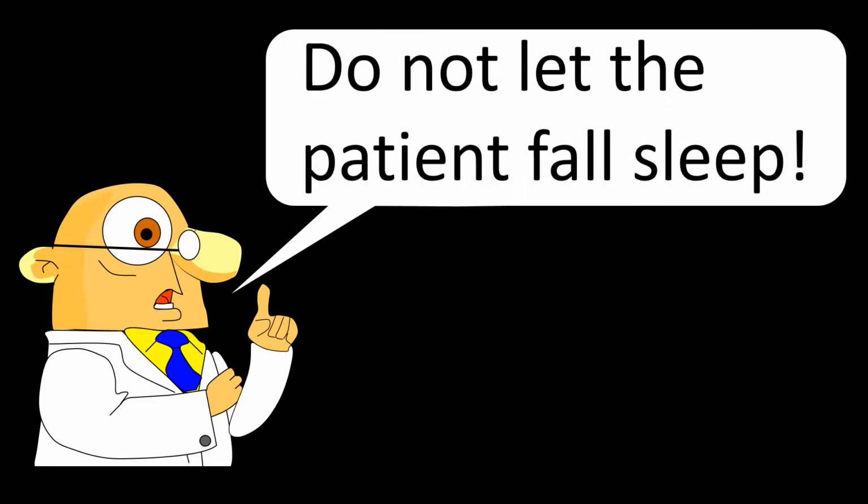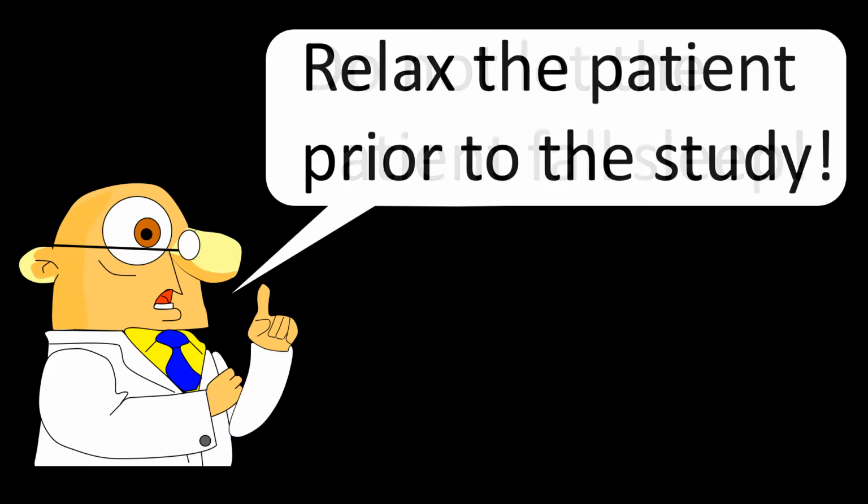My best advice on the subject is not to let the patient fall asleep while a somatosensory evoked potential study is being conducted, and to encourage relaxation, implying that we do not like to see the patient do hard math or any type of very strong strenuous thinking during the study, because more confusing patterns tend to appear.